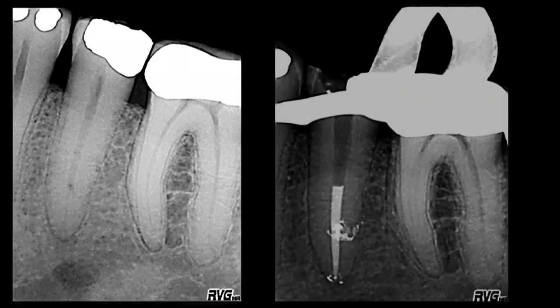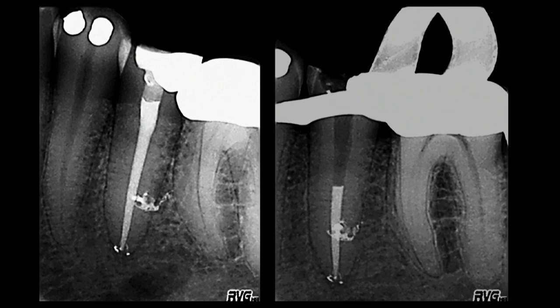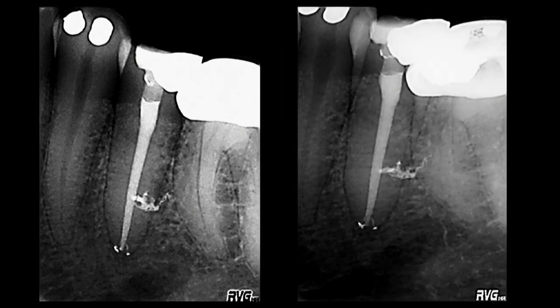All we ever really wanted was to be able to take a patient, let's say the premolar is the tooth that needs endodontic care, and when we make a down pack, we have appropriate shapes and hydraulics which, regardless of the horizontal view, the walls are smooth. This is all we ever wanted.